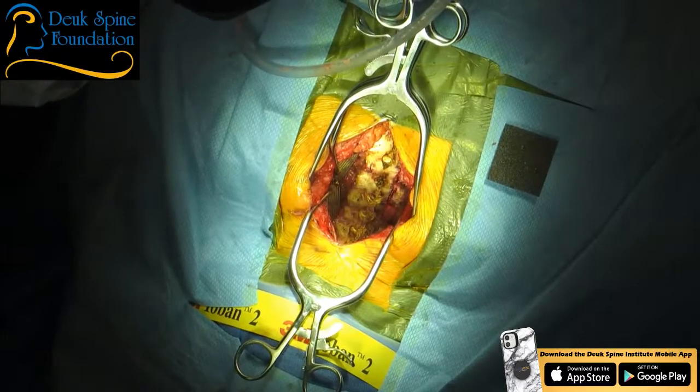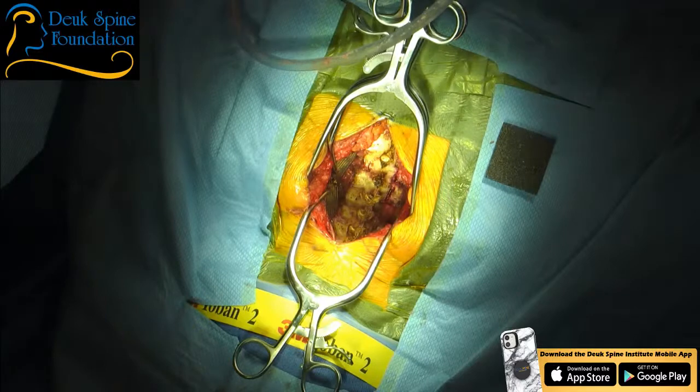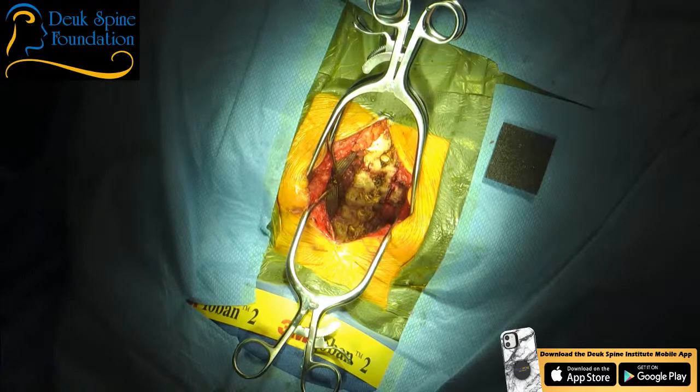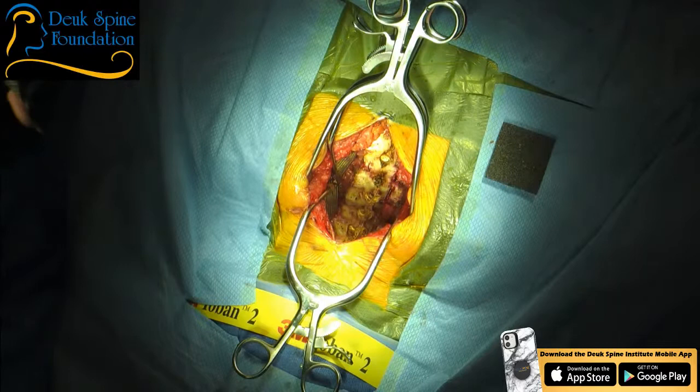But that's something that you spine jockeys need to be aware of: just because we do these surgeries and make them look easy doesn't mean they really are. You have to be precise to half a millimeter. I need the drill pedal. You need half a millimeter precision in your work consistently.